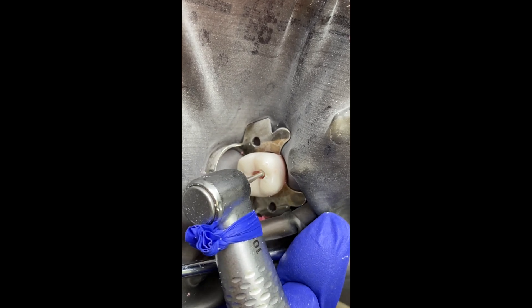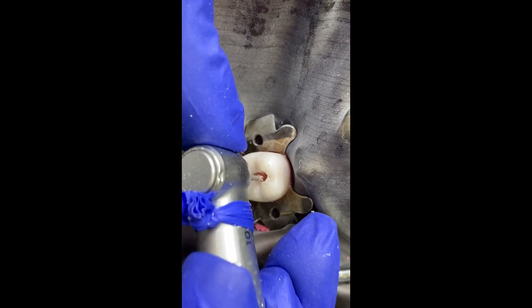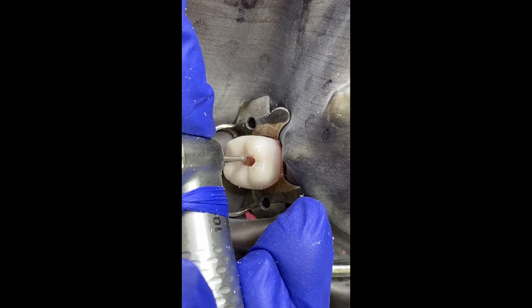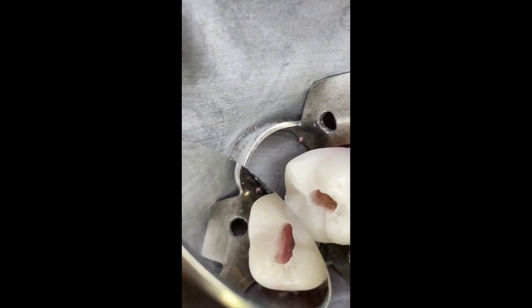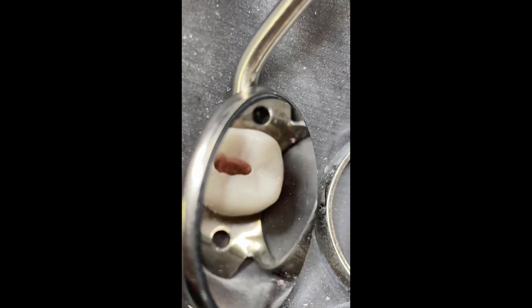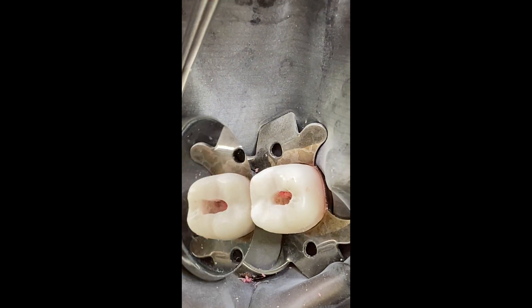To make these final modifications, you're going to alternate between stepping on the rheostat and pausing. Step on the rheostat initially, then stop and have the burr come up not in motion, looking for any catching that you're feeling. Once you find that, step on the rheostat again and proceed to remove it. Now that we've removed all of the excess pulp material, we can see what is still attached to the pulp walls — we'll need to remove all of this material. Remember, if you see red you're dead, so remove all of the red pulp material and remove the ledge that is exposed.